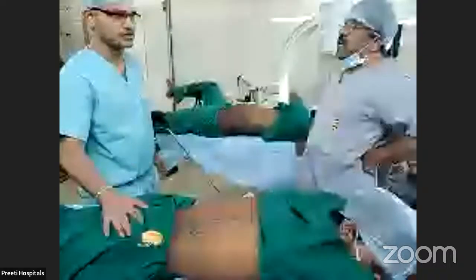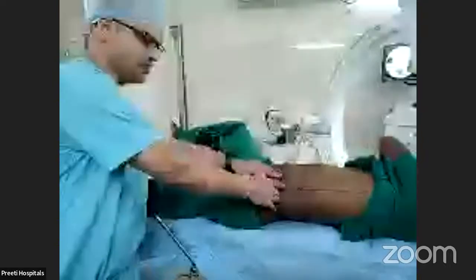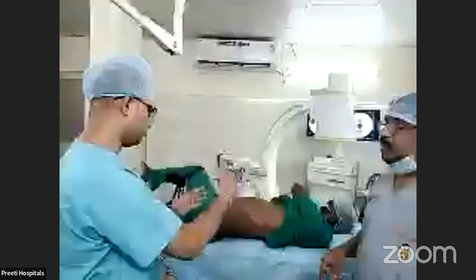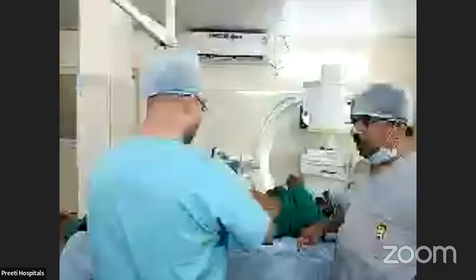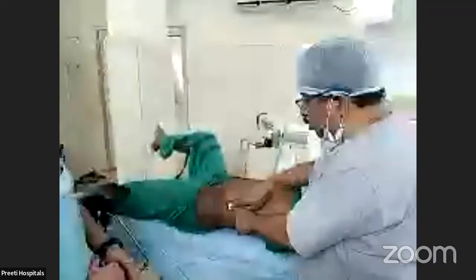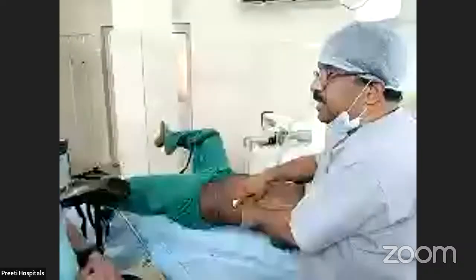Inferior calyx, correct. So this iliac crest will come into view. If I am doing it, there is no lateral part of the calyx. Can you go from the middle calyx to the pelvis and then turn here? Difficult or easy? Difficult. Why difficult? Because we have to come from below to upper. The middle calyx is here, the inferior is here, the inferior calyx stone is here. So you have to look up. You come from the calyx to the pelvis and then look up.